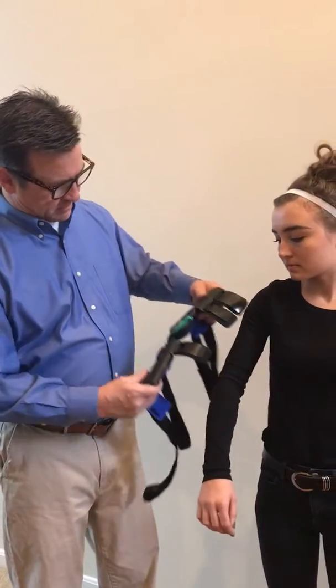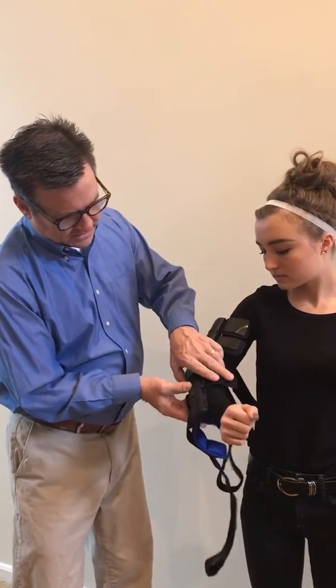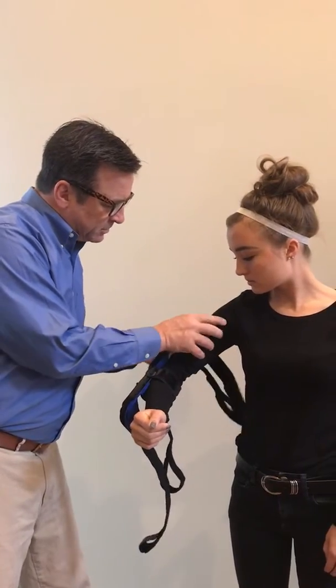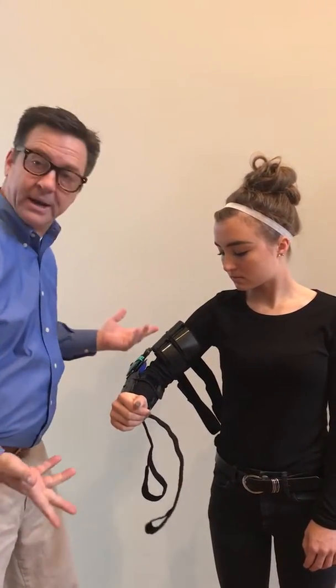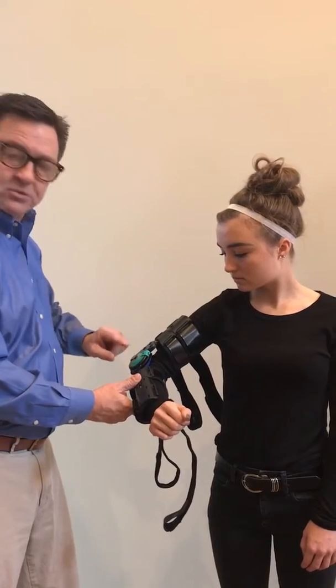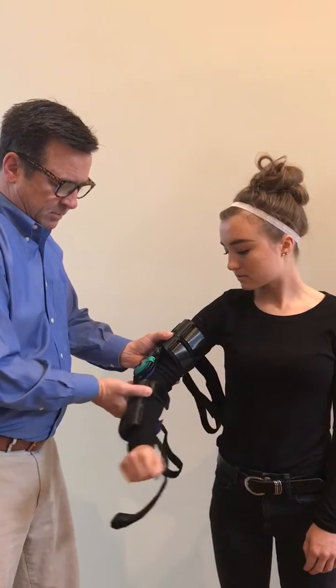You place the opened-up brace on a bent elbow, and then these metal pieces are malleable to the arm and will hold the brace in place while you get the straps ready. Making sure that your hinge is right at the elbow and operating at the apex of the elbow.